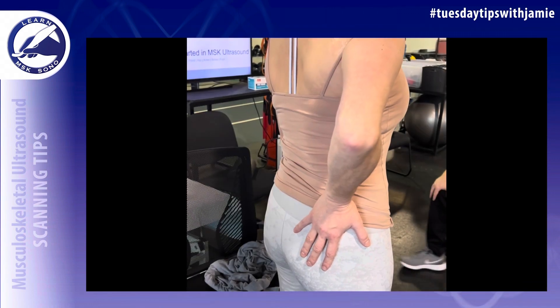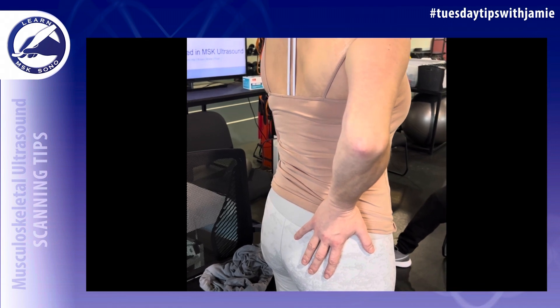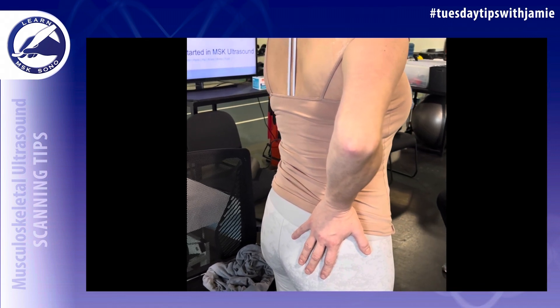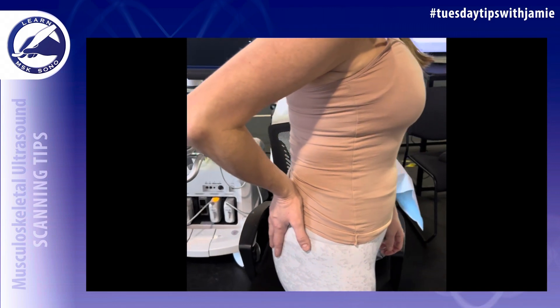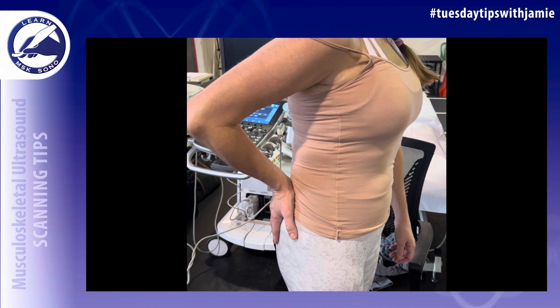Have the patient place their hand in a modified cross position with the palm down on their buttock — you can tell the patient to put their palm down in their back pocket. The patient can be seated; the standing demonstration was just for instructional purposes.